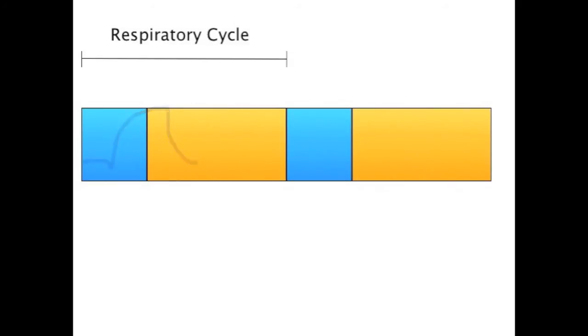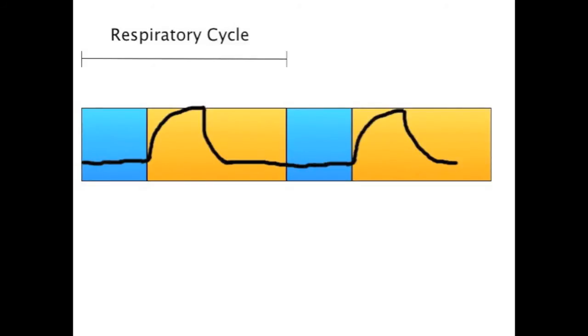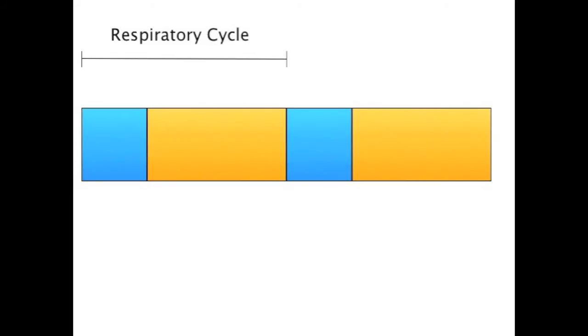If the patient does not trigger the ventilator, the machine goes ahead and delivers an untriggered mandatory breath. In this way, the ventilator ensures that a mandatory minimum quantity of ventilation is delivered. Mandatory breaths may be either pressure regulated or volume regulated in nature. Like ACV, the patient-triggered breaths can be identified by the negative pressure dip immediately prior to the breath.